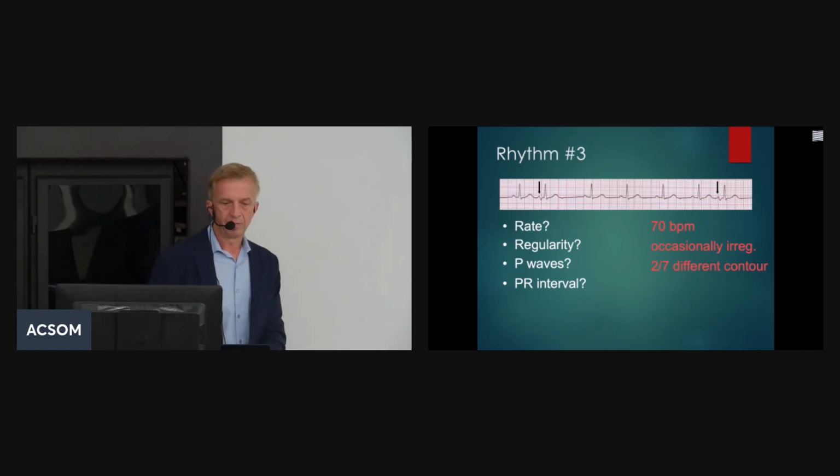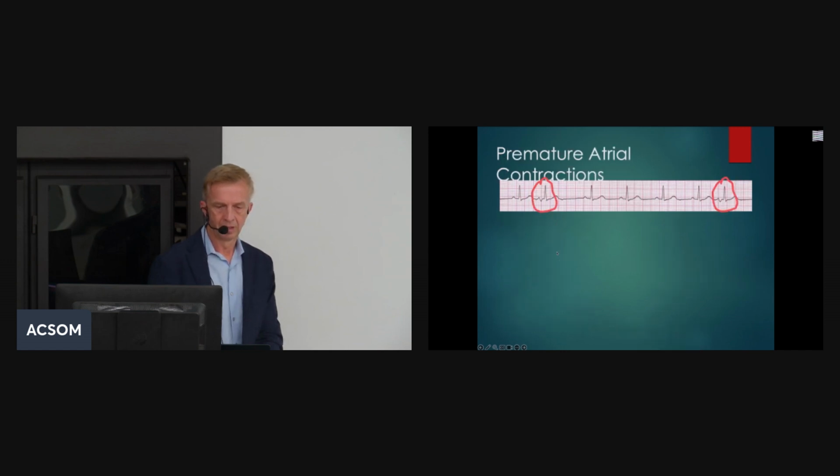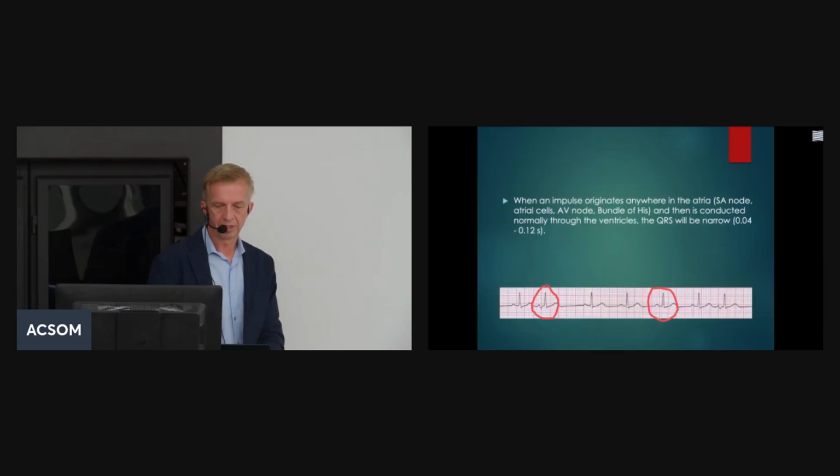So again, remember that there is a pause after the extra beat because of the refractory period of the atrial tissue. So these are the PACs.